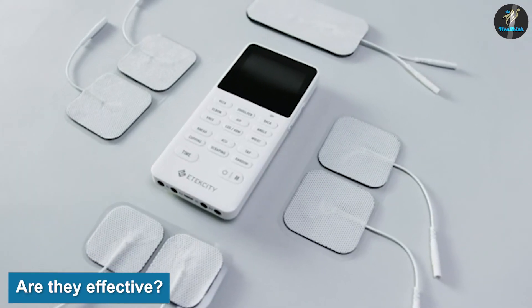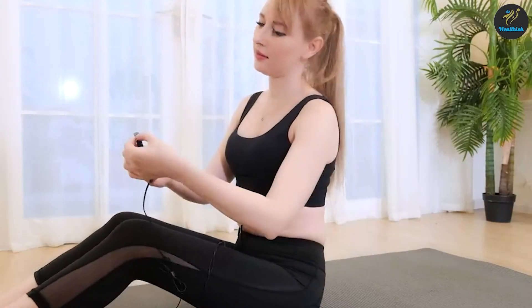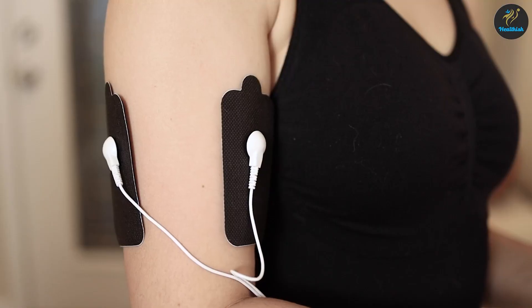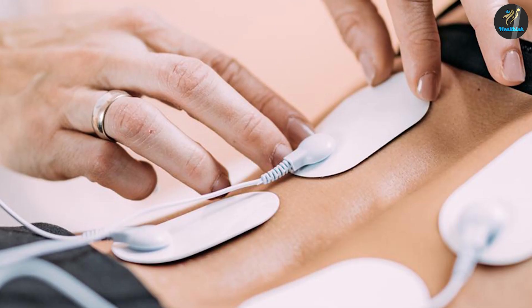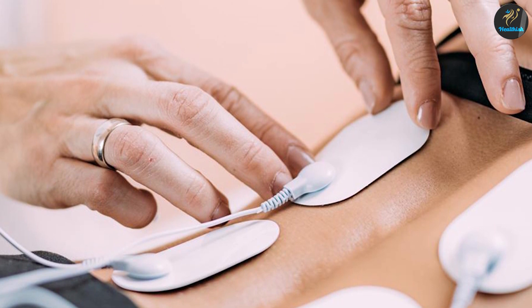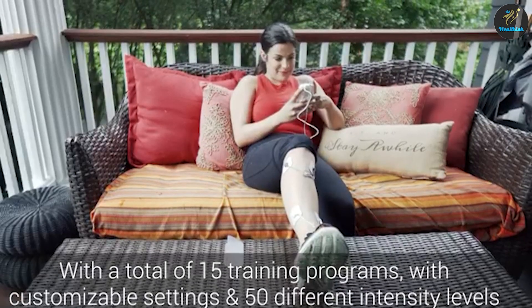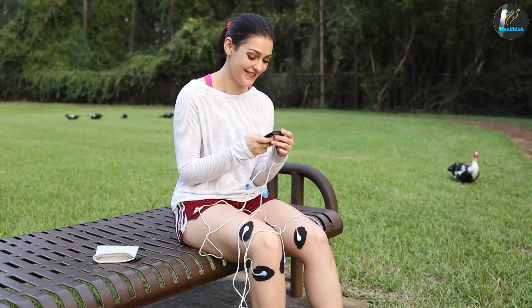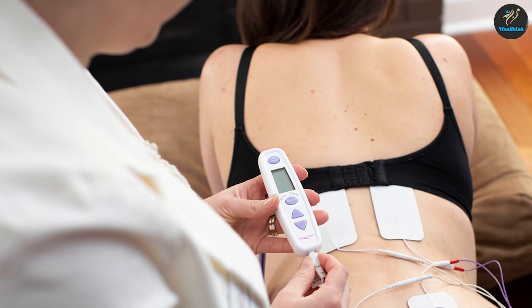Are they effective? The research on electrical stimulators is mixed. While TENS machines have been in use for decades, few quality studies have proven their effectiveness. Both concluded that more research was necessary. In addition, a Cochrane review from 2019 found no evidence to either support or reject the use of TENS units among people who had chronic pain. Supporting research, like a 2018 study, shows the effectiveness of EMS when used on people following orthopedic surgeries. A 2012 study evaluated the use of EMS among elite athletes, and the authors concluded that EMS devices were a promising alternative to traditional strength training.